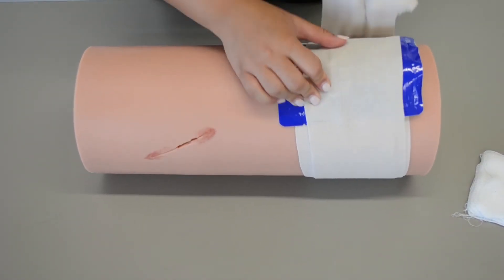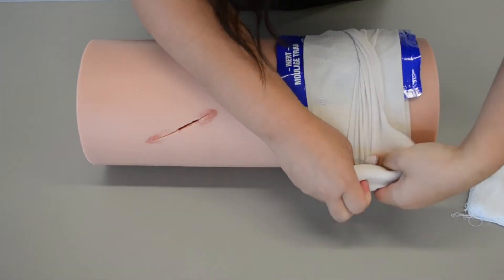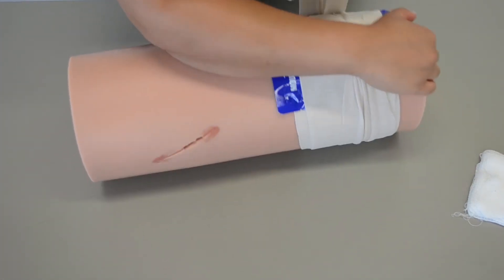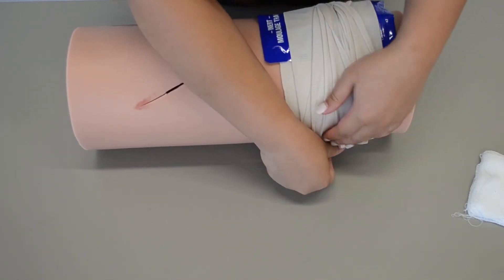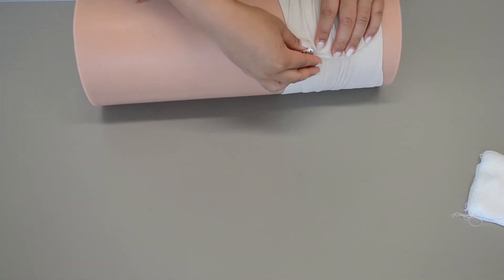Then I'm going to make this a pressure bandage by twisting 90 degrees, going around so it maintains direct pressure — nice and tight. I'm going to twist again and secure it with pins, or whatever you guys have, or tape.